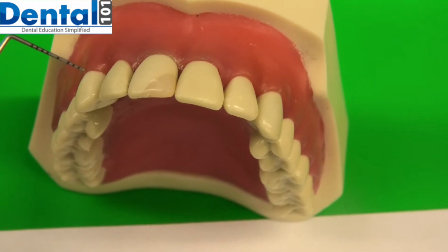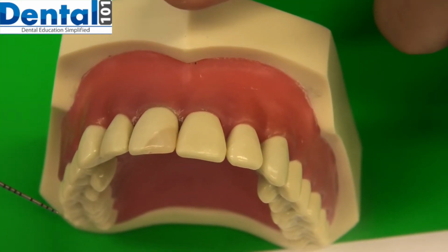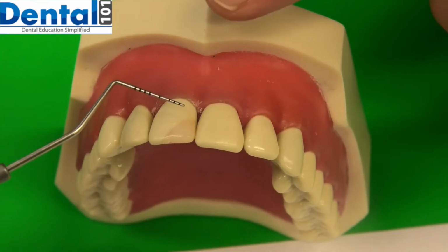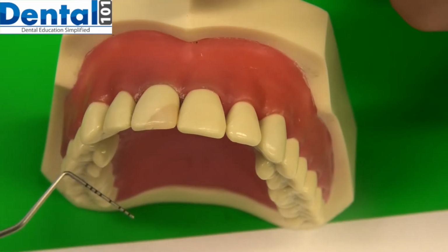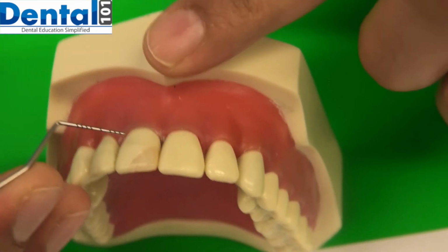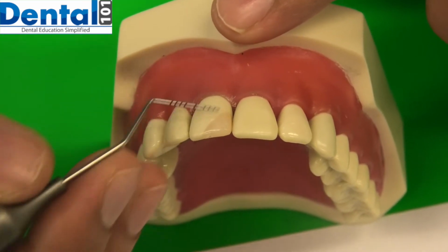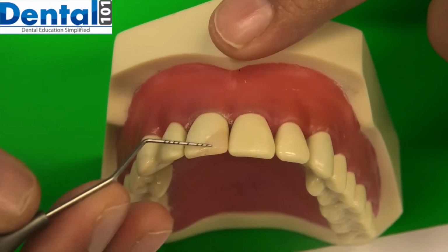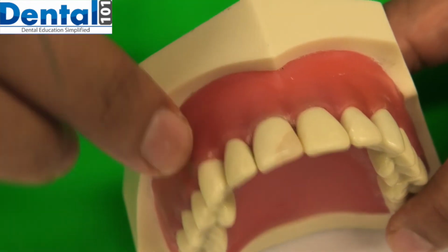For composite, I don't prefer the red Soflex, especially because it is too coarse, so there is a chance that it can damage your tooth structure. So try to start from the orange disc, and always be careful while finishing the surfaces of the restoration. Don't touch your disc to the tooth structure or adjacent tooth or even the gums.